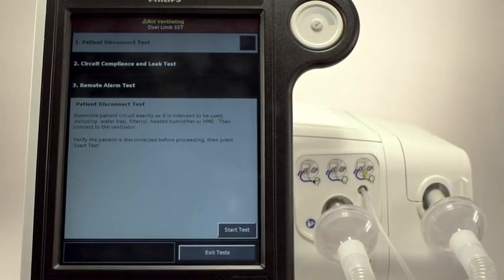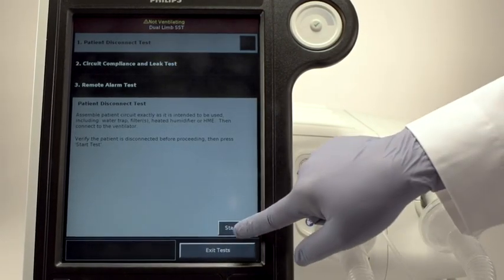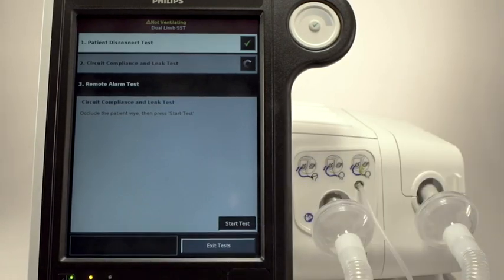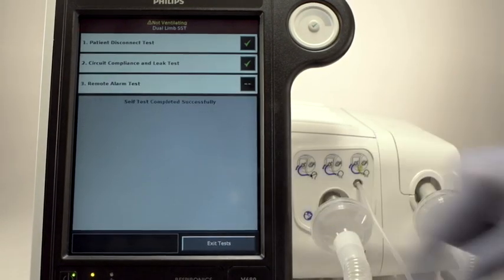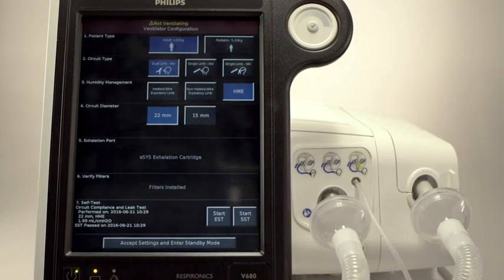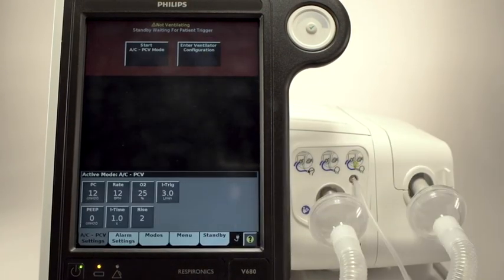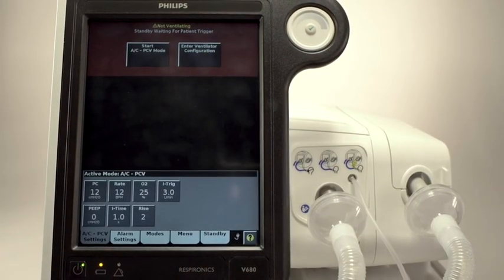Follow the prompts on the screen to guide you through the test. If there is a remote alarm in use, the functionality can be tested. If not, you can skip this test. Once everything checks out, touch Exit Tests. Then touch Accept Settings and Enter Standby Mode. Once again, we enter the Standby screen.